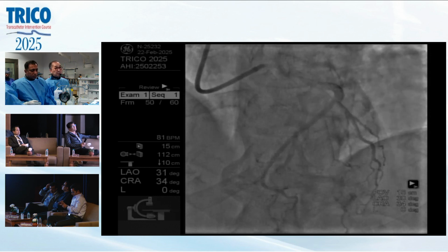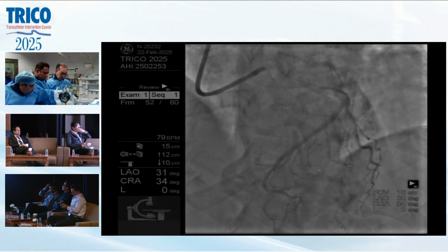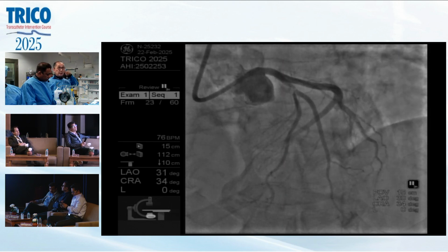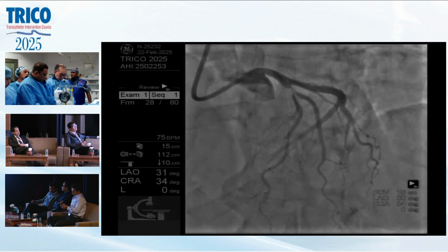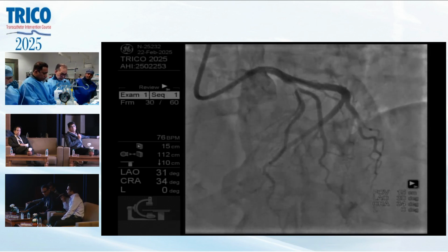So I think there's a 111 lesion, right? If there's a 111 lesion, I think the vessel is a big diagonal or dual LAD. So I like to do a two-stent technique in this situation. What do you think, panel? One stent or two stent?